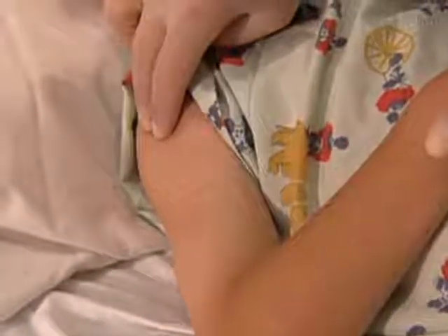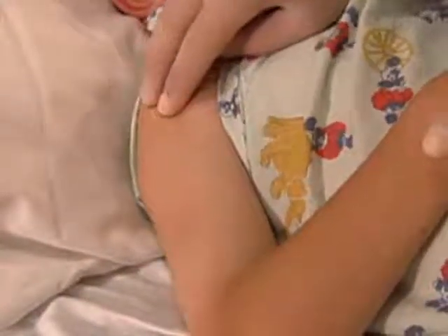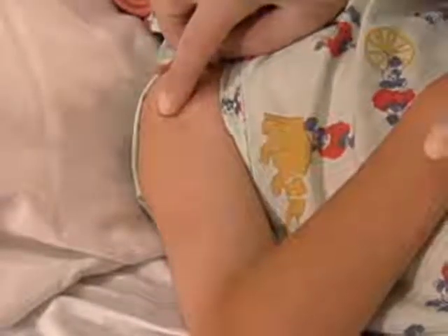Just anterior to the midline of the lateral shoulder and distal to the shoulder joint. This bony prominence is the insertion site.